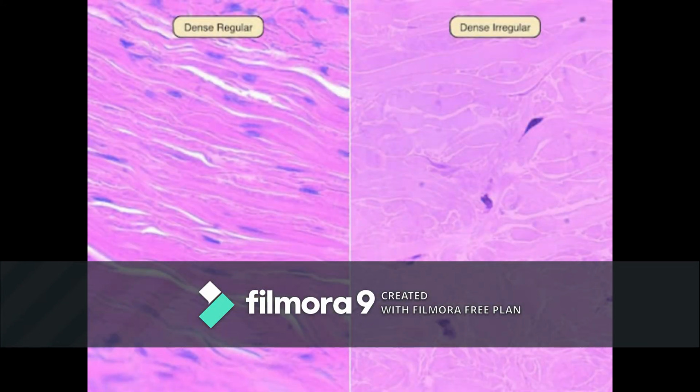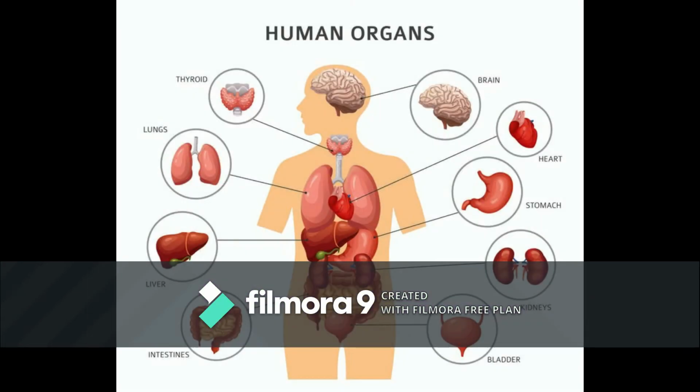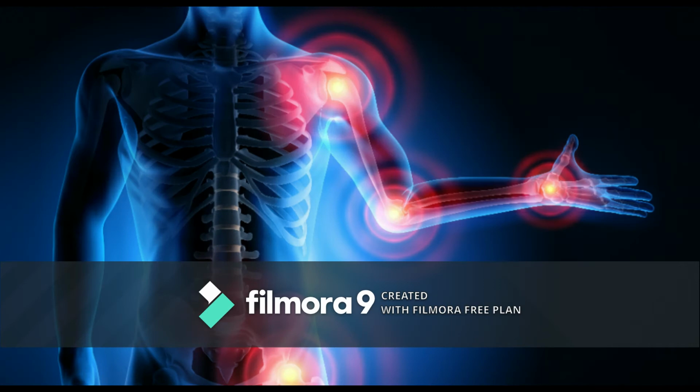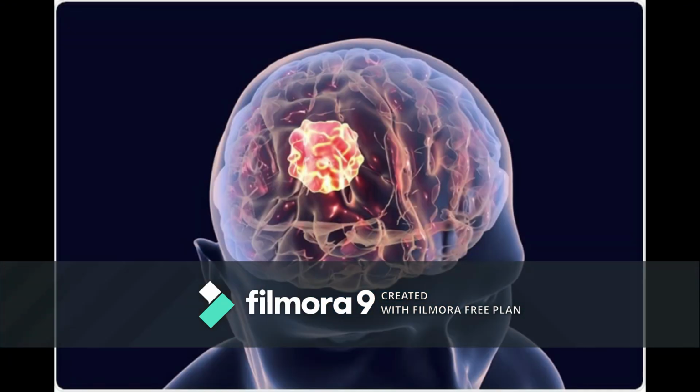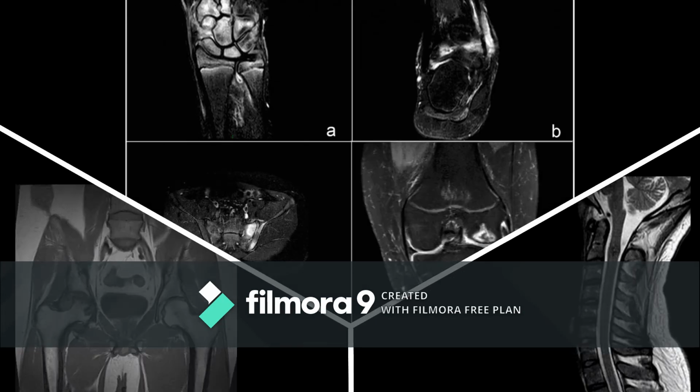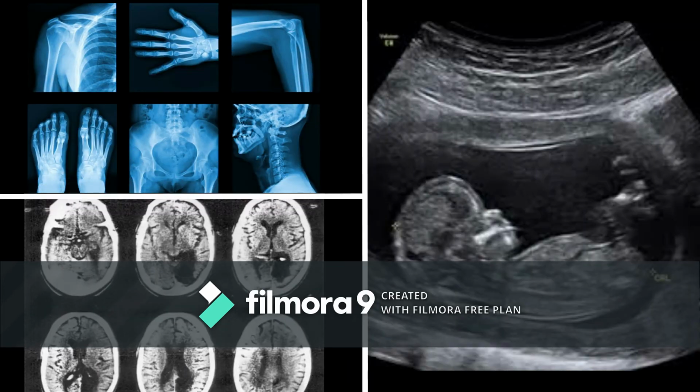MRIs are commonly applied when individuals develop irregularities that exist within the tissue or organs in their body. These issues allow medical experts to analyze the development or inheritance of strokes, musculoskeletal disorders, tumors, and other irregularities within the body. MRIs can also be utilized to determine the potential effects on the brain, lungs, and bones such as the pelvis, spinal cord, as well as joints by producing images that cannot be normally detected via X-rays, CAT scans, or ultrasounds to appropriately diagnose the issues affecting the individual.